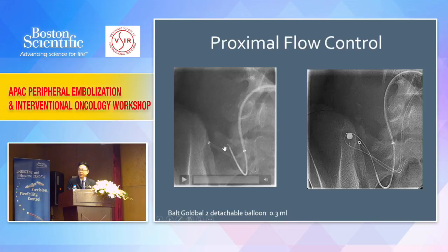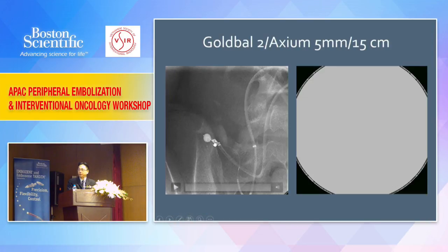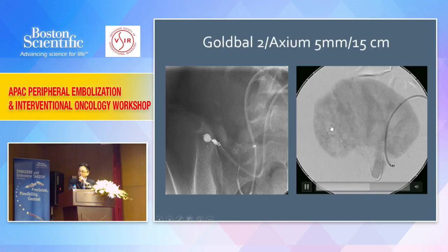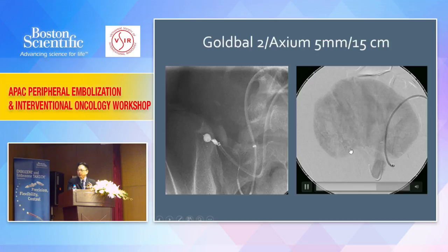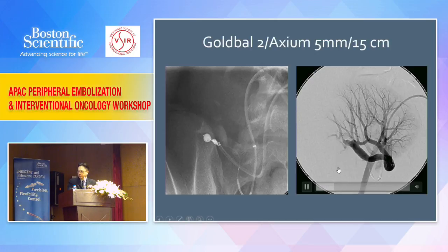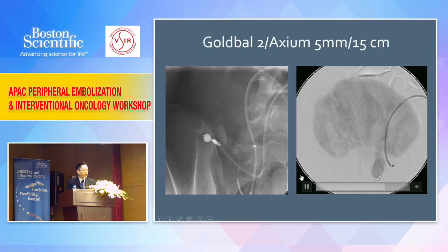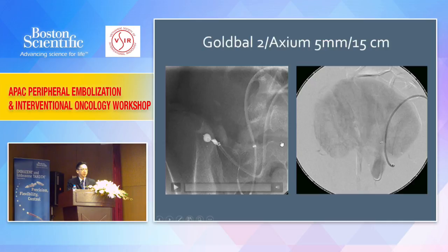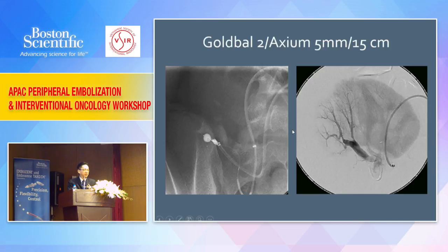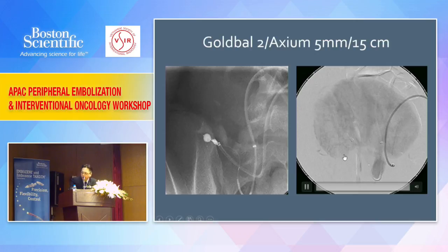Anyway, my catheter, everything is there. It's on the transvenous side, so we just push in the 5 mm Axium coil. This is completely occluded, complete occlusion on table. You see that the perfusion to the lower half of the kidney has returned. So with this super selective and precision coiling, we have avoided any renal ischemia or sacrifice of renal cortex by combining balloon and coil. These are things we can combine in many situations. Combination therapy actually works out very well, and this child has a full recovery.